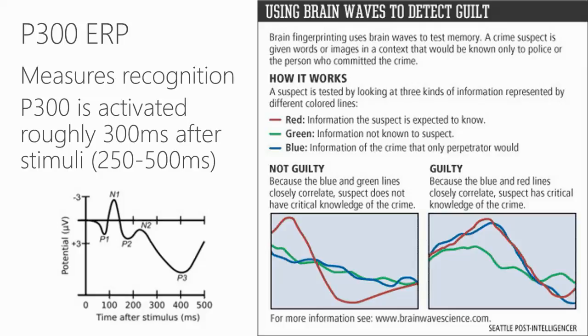But what was actually really useful about this research is that one of the things I was worried about was essentially the sampling rate. I didn't know if that was enough, because it's sampling, as I said, every 8 milliseconds. When I was thinking about it, I couldn't remember how fast these brain responses actually happen, like the decision to lie or not lie, and what the time frame there is. So this at least gave me some sense that the flash of recognition is happening in hundreds of milliseconds, so I'm probably okay with my sampling rate. That was some neat knowledge I got out of this as well. So, kind of cool stuff.